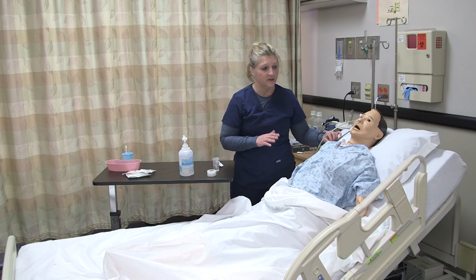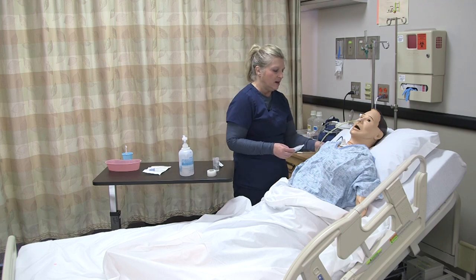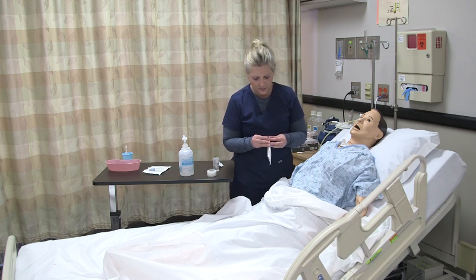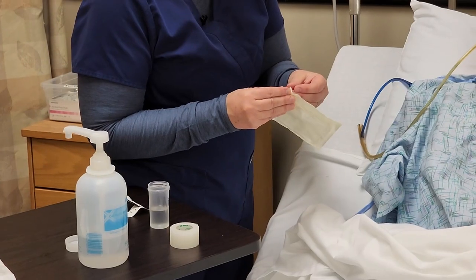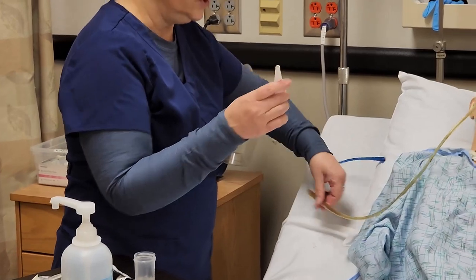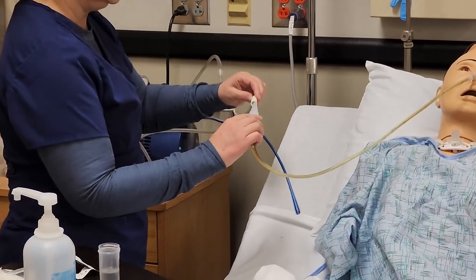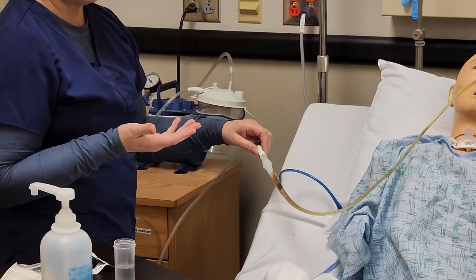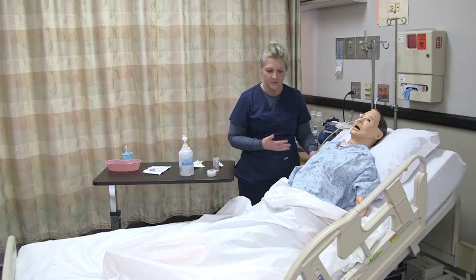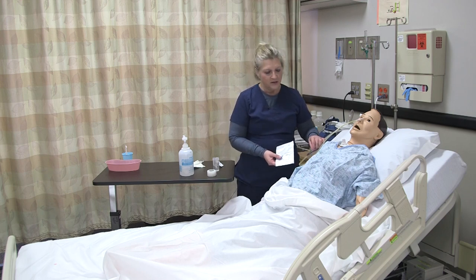Now that this tube has been hooked to suction and verified by chest x-ray, let's talk about how to hook it up to suction. You'll need a connector — this is a connector, which is cone-shaped — and you use that to connect to the suction tubing, placing it at the exit port of the sump tube. Then you hook it to your suction tubing and set your suction as prescribed by the provider. If you need to stop the suction and clamp this tube, you can use a pigtail clamp on the end of the tube to clamp it.